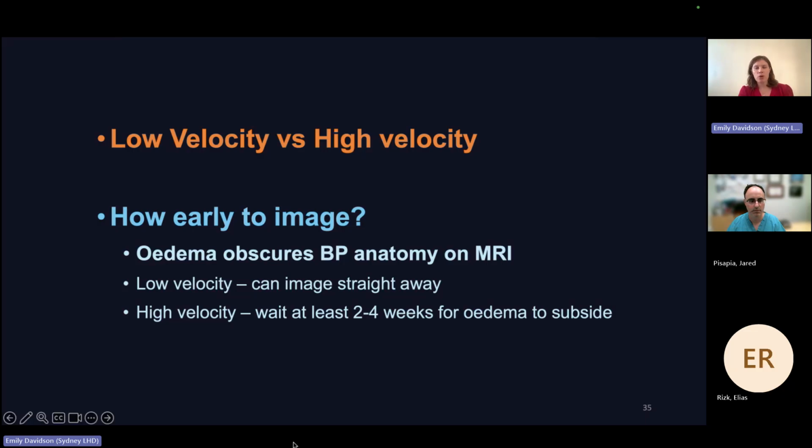I also advocate for not doing emergency after hours brachial plexus imaging. I really want my best team on site, my most senior radiographer or technician that knows how to scan these. And I want the patients to be comfortable, relaxed, not move during the scan. If you're doing these after hours, often patients are very stressed, they're unwell, they've got other problems, they've got lines and tubes, and then your picture's essentially non-diagnostic. So you want everything to be nice and relaxed and in hours and not rushed.